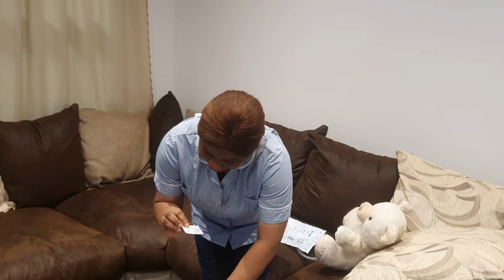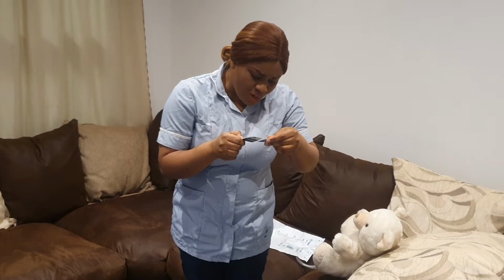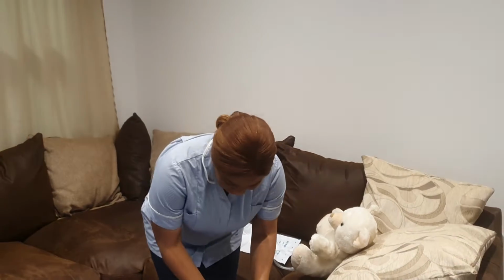So this is my cleaner wipe. This cleaner wipe is valid. The expiry date is 2023. So this cleaner wipe is valid. I'm happy to use it, guys. I pop it in my tray I've cleaned.